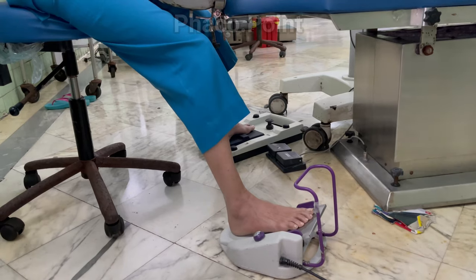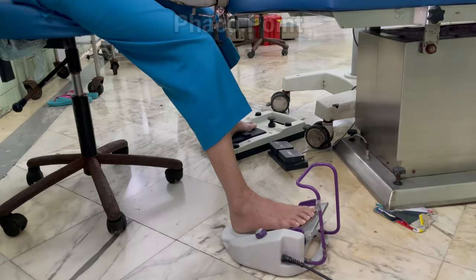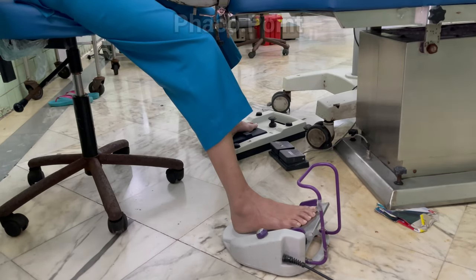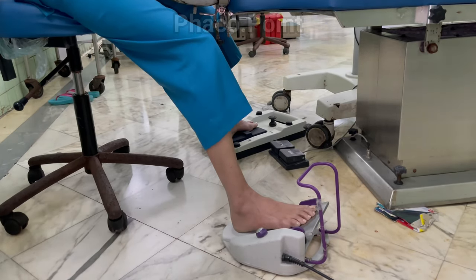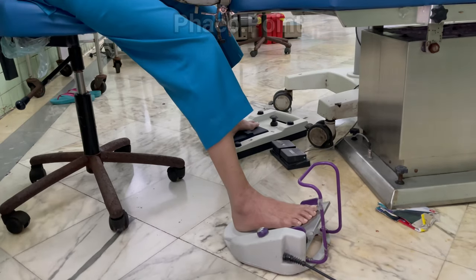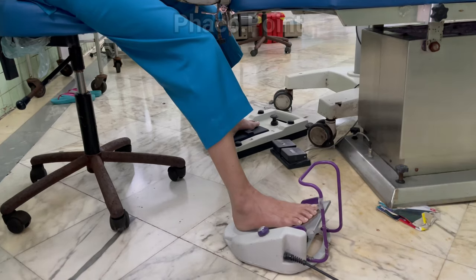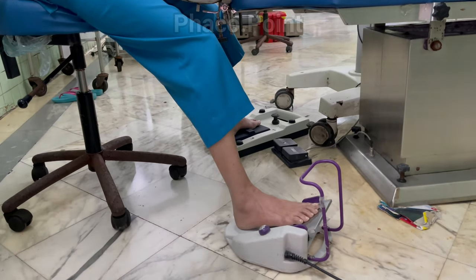Whether or not the surgeon chooses to wear slippers is a very individualistic decision. Personally, I do not like to wear slippers because my mind is tuned to the tactile stimuli from the undersurface of my foot as it rests on both the phaco and the microscope foot pedal.